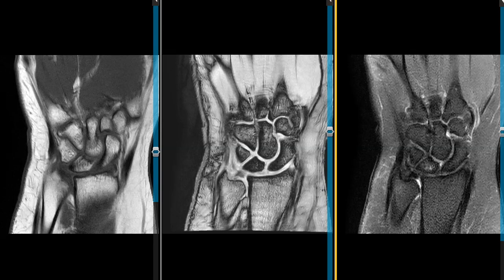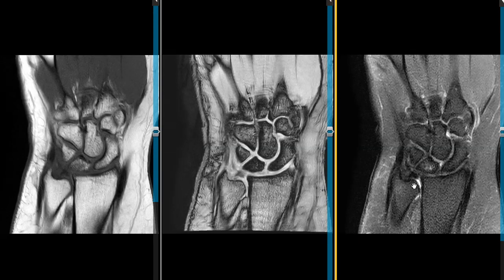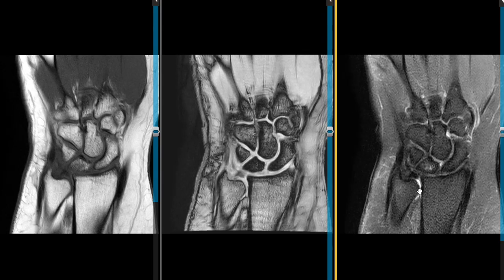Instead we see some very subtle patchy brightness right there. We also see that the ulna is a little bit short, so this space here is widened. This is the triangular fibrocartilage — it's a little bit thicker, so it can be compensatorily thickened. We have a negative ulnar variance; we do not see a tear. There's a little bit of fluid in the distal radial ulnar joint.